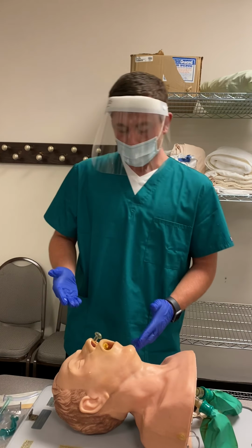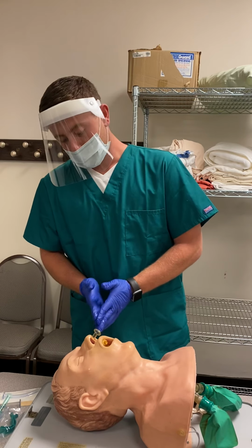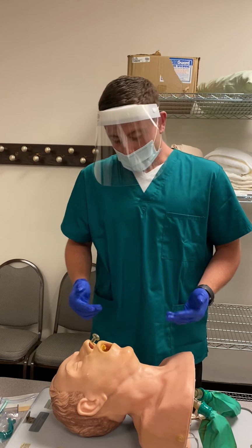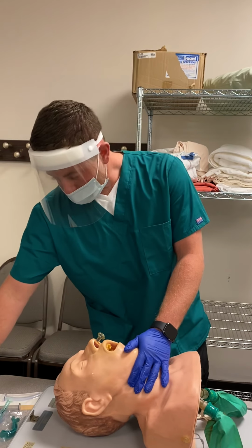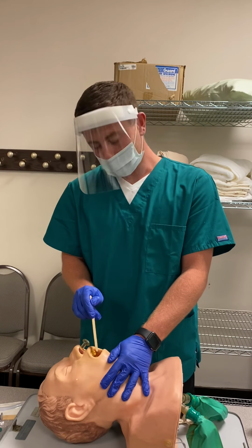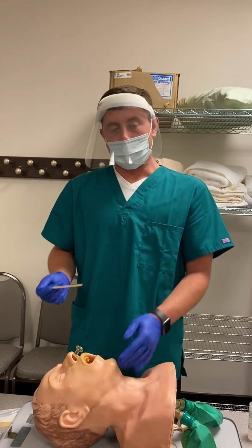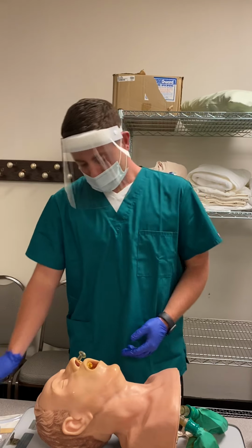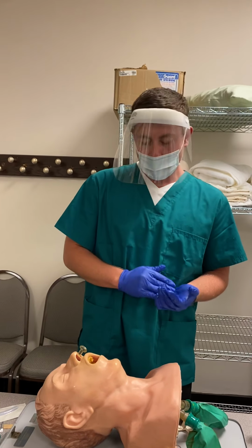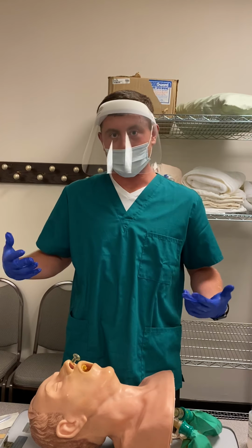And then you're going to want to continue through until there's a little space left and the flange is sticking out. After doing so, you're going to want to potentially use a tongue depressor and just ensure that you can see it in the back of the throat. With that, you'll reassess the vital signs and then chart down everything in the patient's chart.